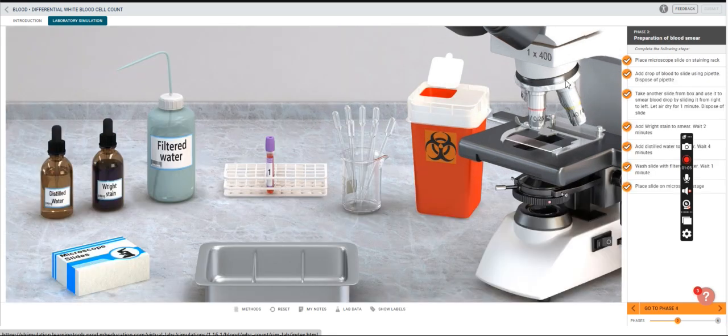When you go through and do all of these steps, you just follow the steps along. Again, I think the tricky part with this sim, maybe the part that's not as user friendly, is once you've used something, dropping it into the biohazard spot. So if you've used a slide or something, you have to click it off and then it drops into the biohazard spot for disposal. That's true of the regular lab environment as well, okay?